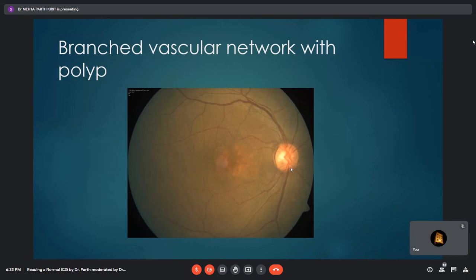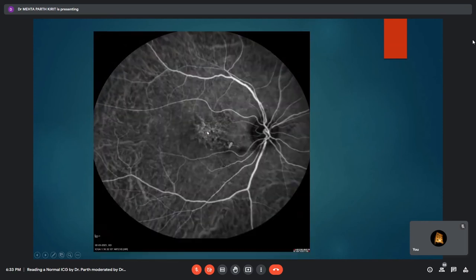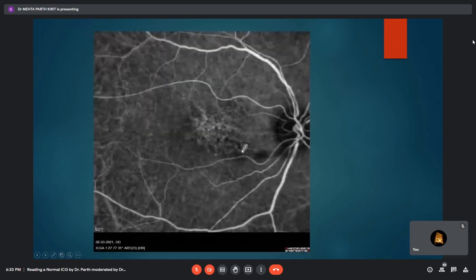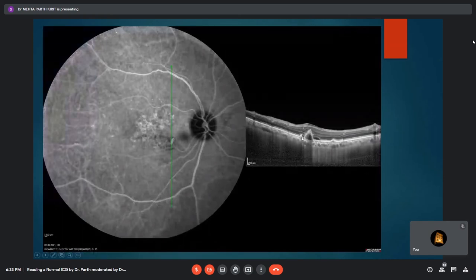A 73-year-old male with gradual diminution of vision in the right eye shows a large area of RPE alteration centered at the fovea and extending nasally. The early phase of ICGA demonstrates a distinct lacy network of vessels within the choroid, delineated better in later phases. A well-defined hot plaque-like polyp with focal staining and surrounding hypofluorescence can be seen in later stages. OCT through the lesion shows RPE alterations with an elevated contour of the pigment epithelial detachment and a thumb-like PED.